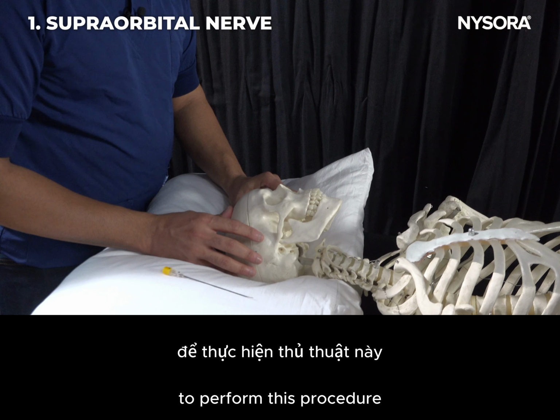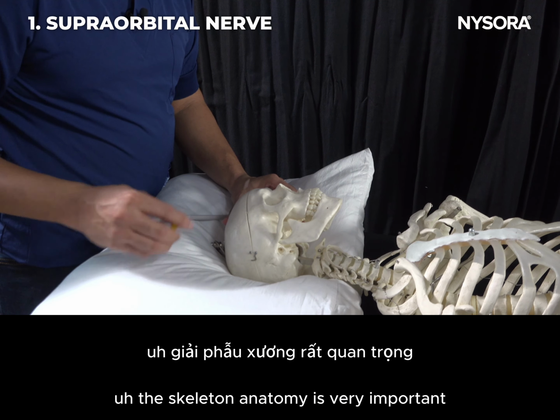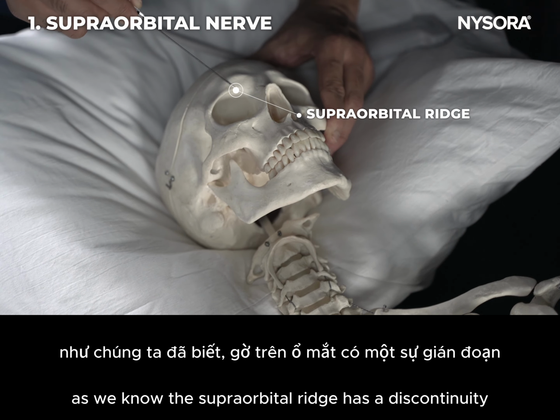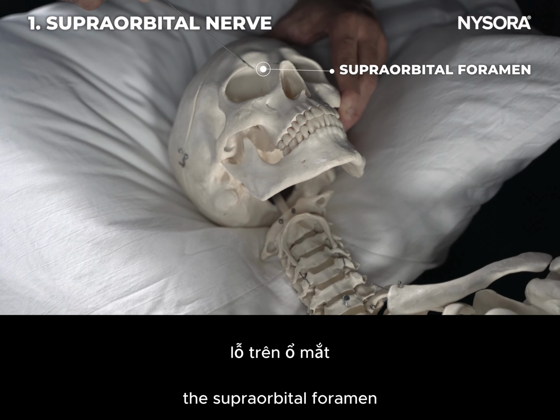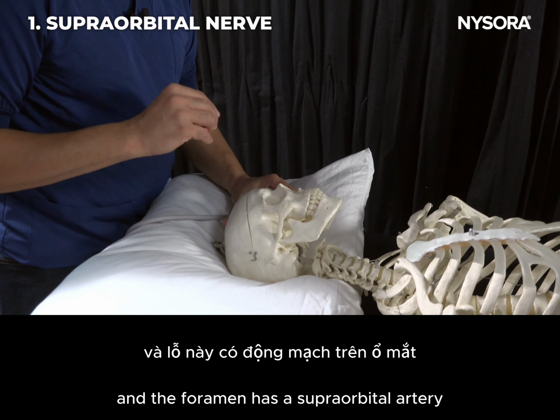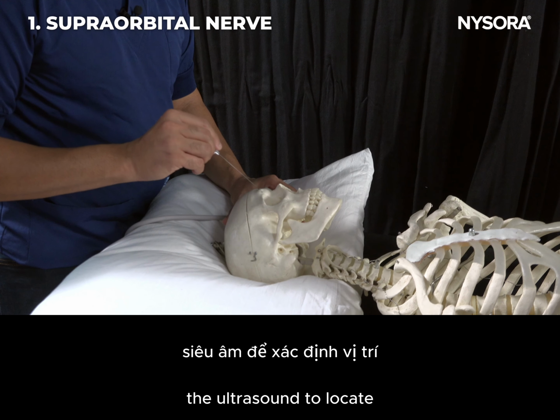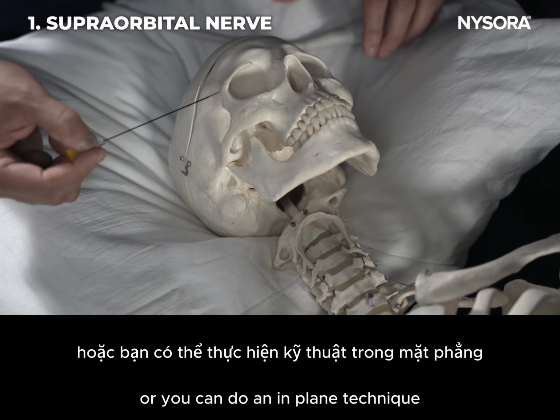To perform this procedure, the skeletal anatomy is very important. As we know, the supraorbital ridge has a discontinuity. That's where you would be able to locate the supraorbital foramen, and the foramen has a supraorbital artery which you can put the color Doppler on the ultrasound to locate. And you can do an out of plane technique or you can do an in plane technique.